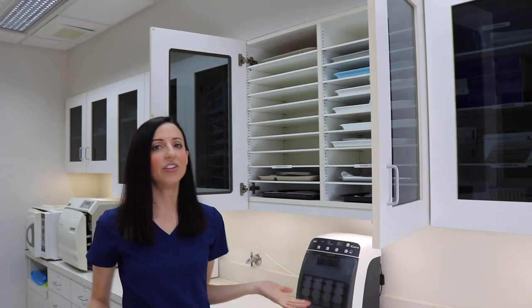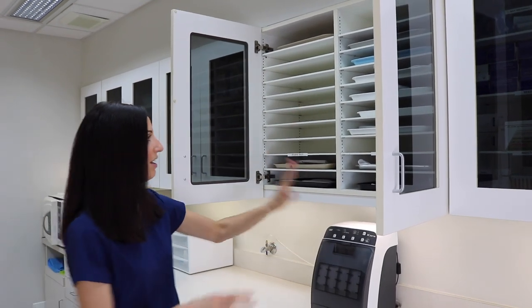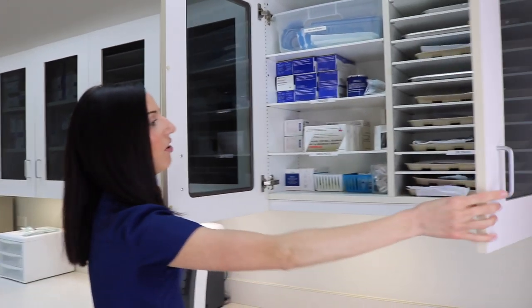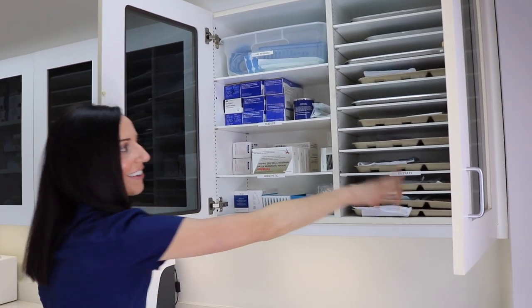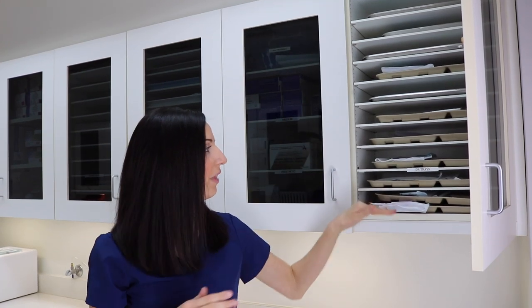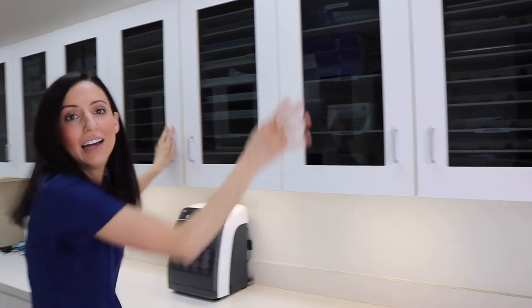Over here we have our pre-made trays. These are all the hygiene trays, which I'll show you in a second. We also have our anesthetic and all the doctor trays — labeled as 'doctor trays.' Throughout the day they're prepped so everyone knows what procedure needs what.